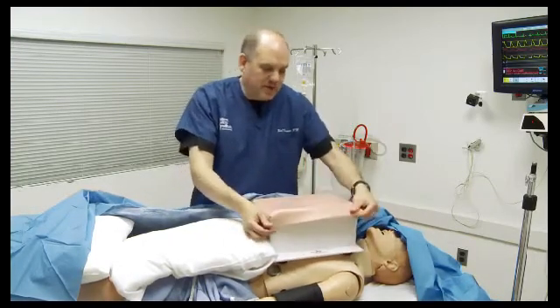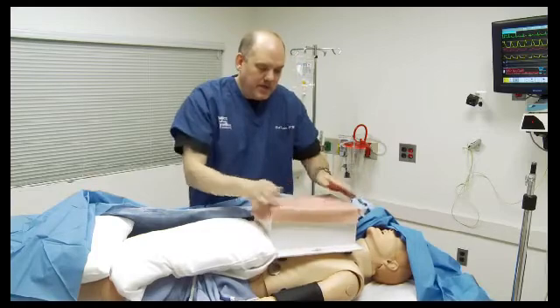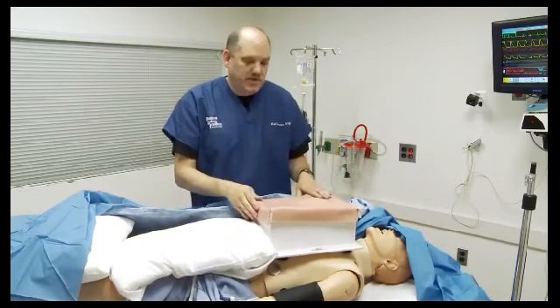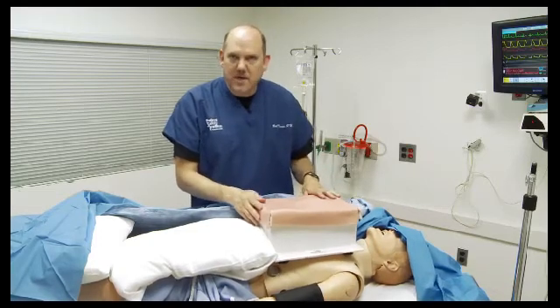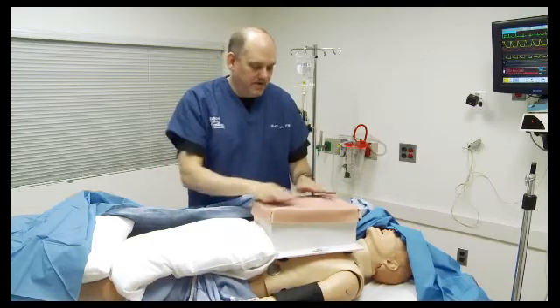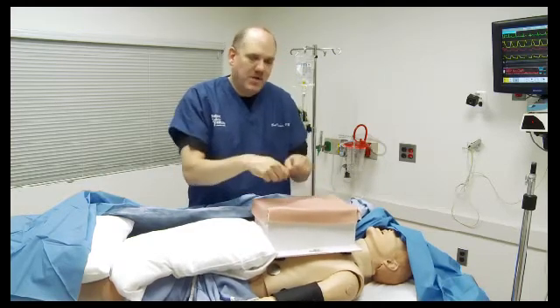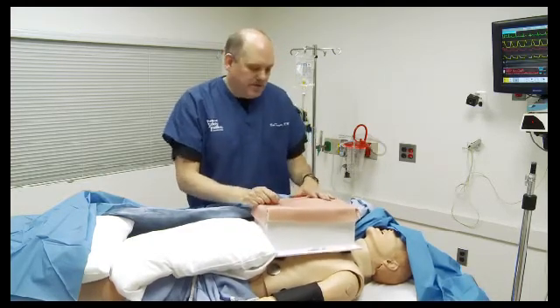Our learning objective here is that the team can continue to lead the code even while being distracted with a cognitive load — in this case, the cognitive load being the operation of opening up the chest and ligating a bleeding vessel.